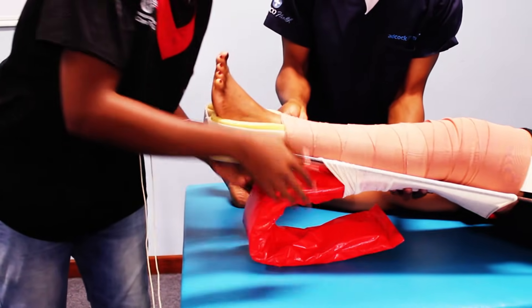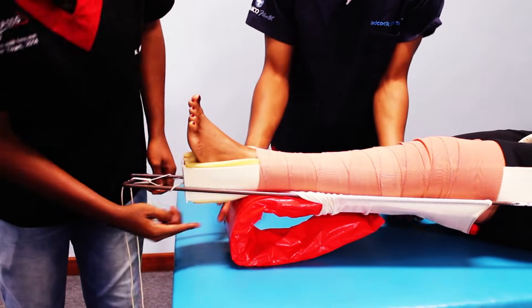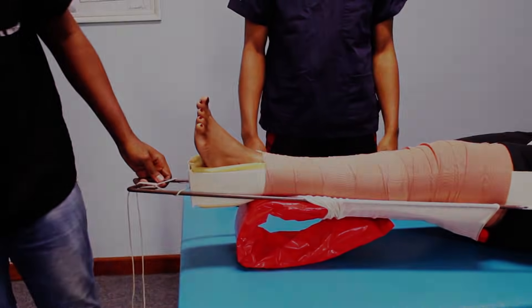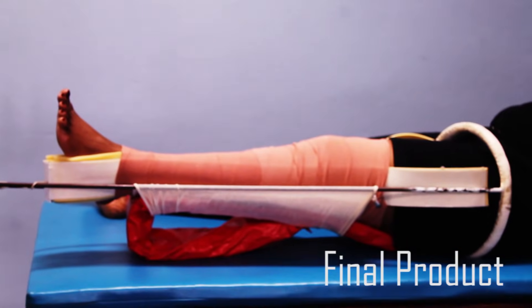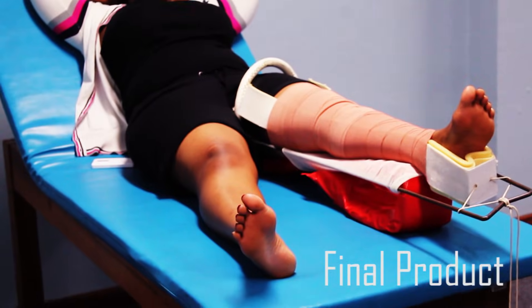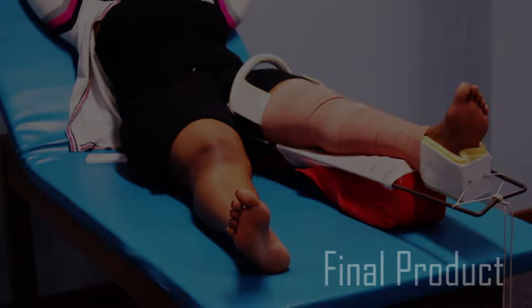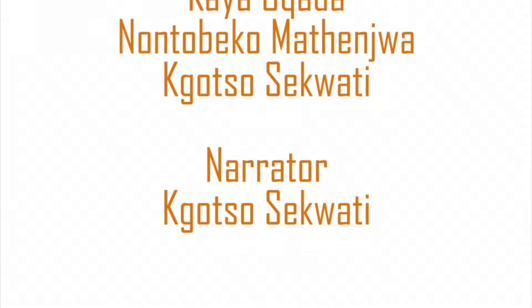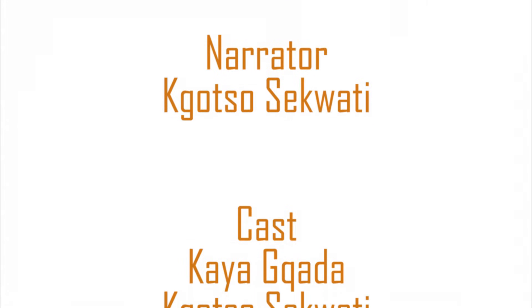At the end, make sure that the heel is free. This is a completed Thomas splint. Remember to regularly check your patient's neurovascular status to prevent the formation of compartment syndrome. Remember that a Thomas splint is temporary and surgery is the ultimate treatment.